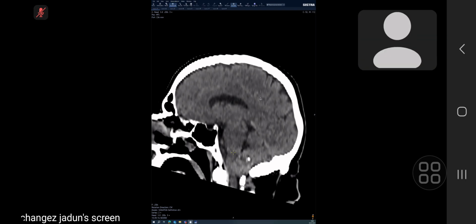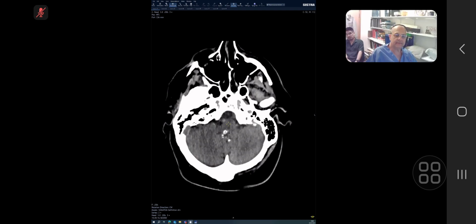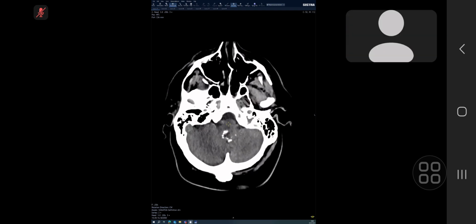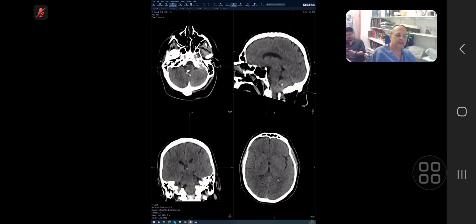It could be an incidental finding, which could be a neoplasm. Yeah, okay. So this is how it is looking at what you were seeing. Yeah, what sort of a neoplasm can you think of?